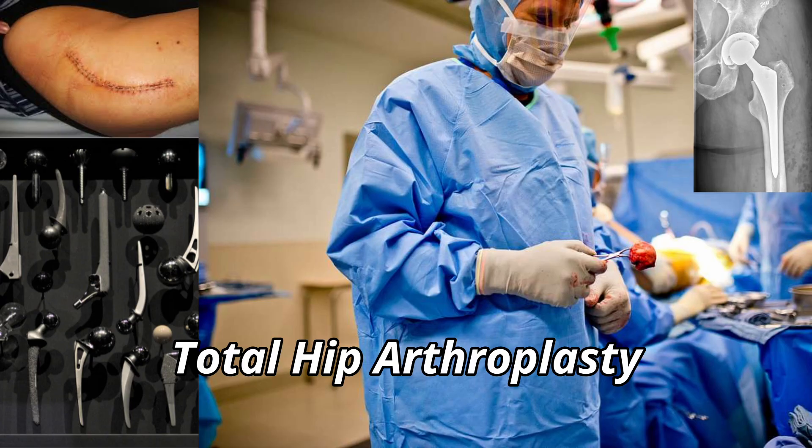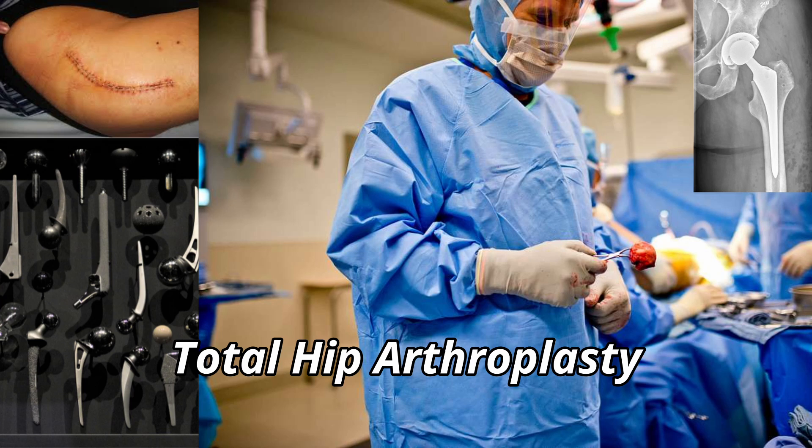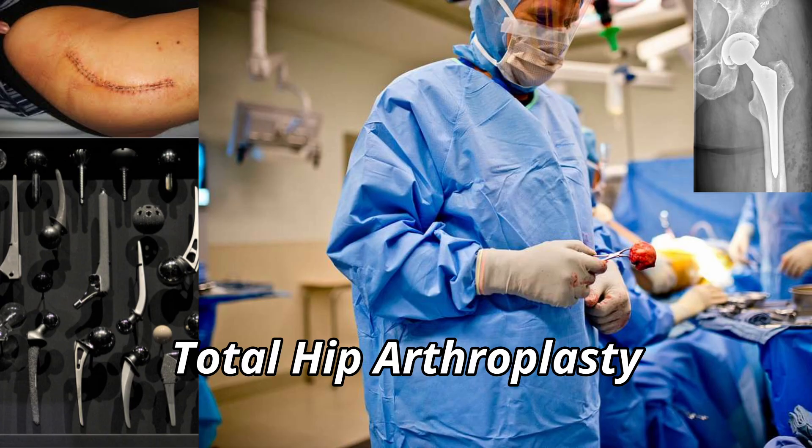Pitfall: Inadequate protection of the sciatic nerve, which lies just deep and medial to the rotators, can lead to devastating injury. Always use blunt dissection and place retractors cautiously.